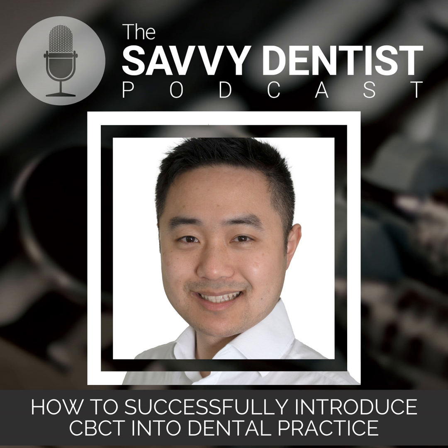The biggest pitfall that we definitely see is missed diagnosis, where there is pathology to be seen in the field of view of the CBCT, but people are simply not looking at it. Or sometimes they see it and they misconstrue it as something else. I'll give you a very interesting story about this. One of my dental colleagues had a patient who came in with several months of right cheek swelling, bleeding gums and facial distortion. The patient went around town seeing a lot of dentists, and they did an OPG.